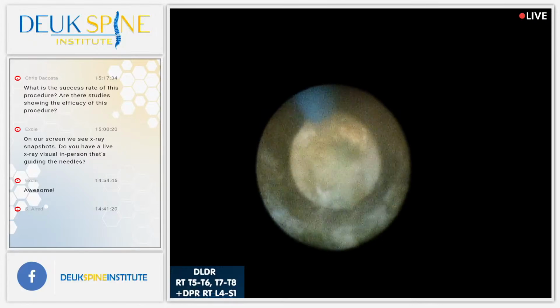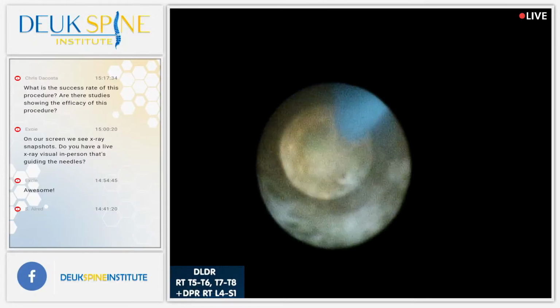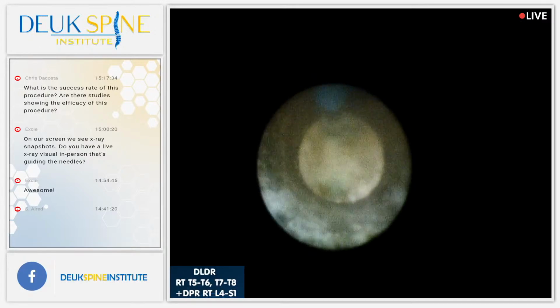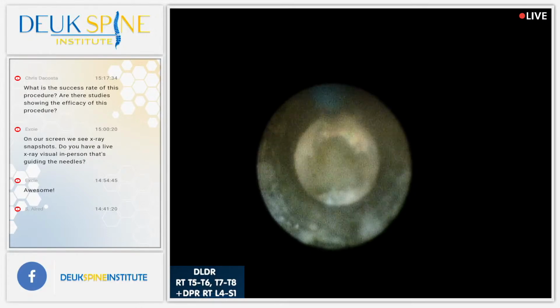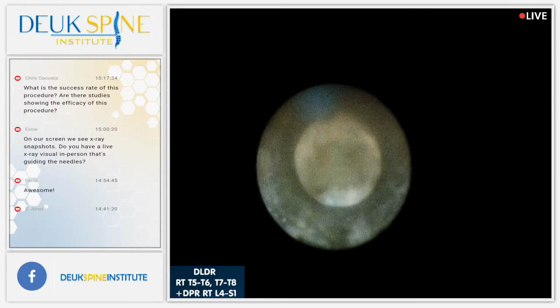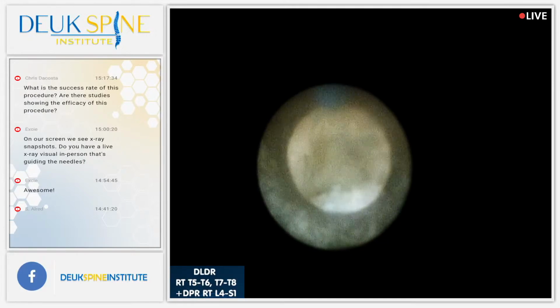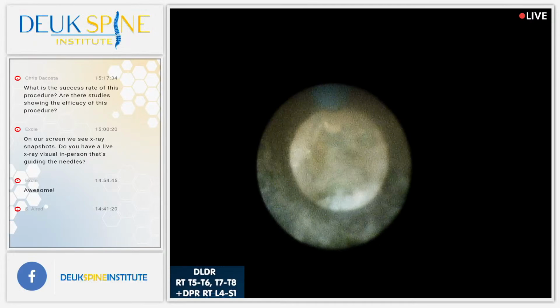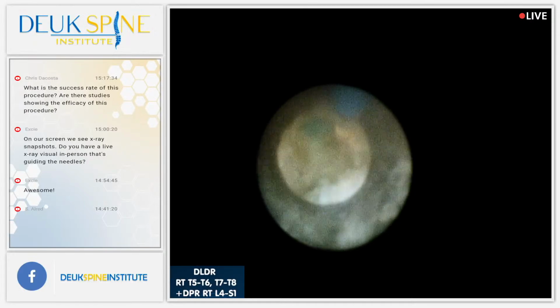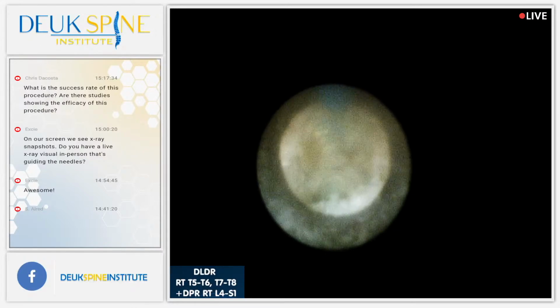So anyway, surgery is going well. We're removing the herniation quite nicely. There is some scar tissue in here from chronic inflammation. And just for the record, for the 5-6 disc, I wasn't able to get in because of some abnormal bone on the side of the spine. But more importantly, I don't know that the patient's having pain from that disc, because where she mapped her pain out before surgery, it's not consistent with that location. When I asked her before we put her to sleep, do you have pain up here? She said, a little, very mild.